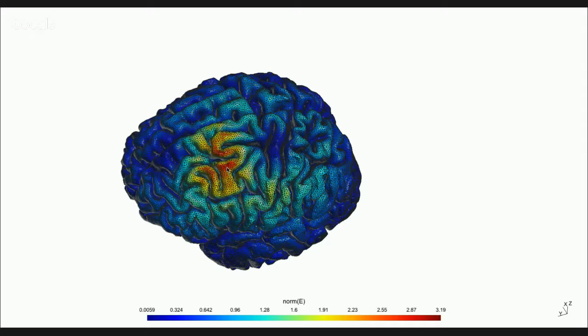At the motor cortex, we have the big advantage of a directly measurable output, MEPs. But for the dorsolateral prefrontal cortex, the other big target in TMS, used for example in depression, we don't have a directly measurable output signal. There, simulations can help to determine optimal positions to maximize the field strength in a certain brain region. So that's basically what we can do with TMS, and maybe go back to the talk.